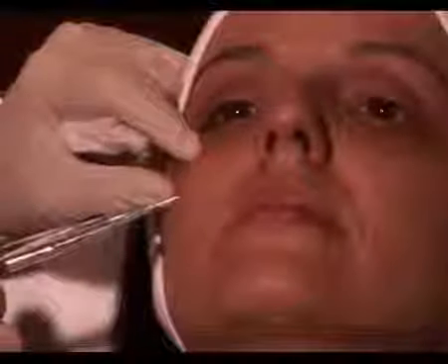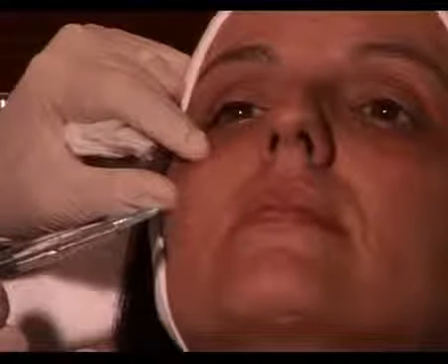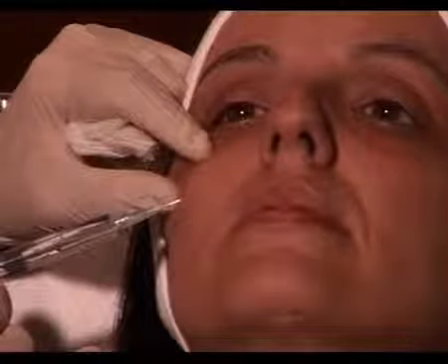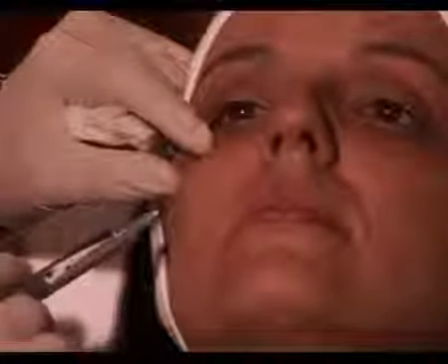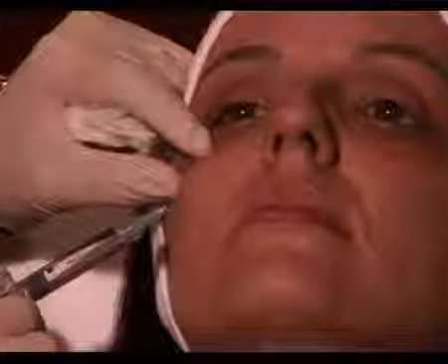And inject a small amount. I'm injecting very slowly. It has been shown that the speed of injection is important. The faster you are, the more problems you're going to get. So you inject very, very slowly. I've injected about 0.6 right now into that area. Now remember, I told you I like to fan. From the exact same injection point, I'm going to switch my needle direction and start going in, injecting as I go.